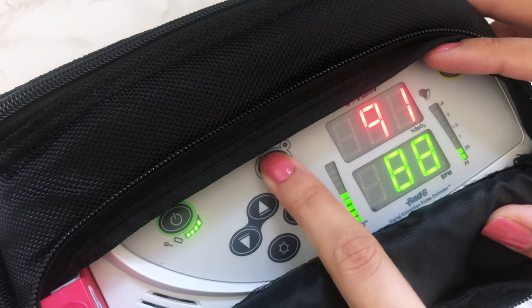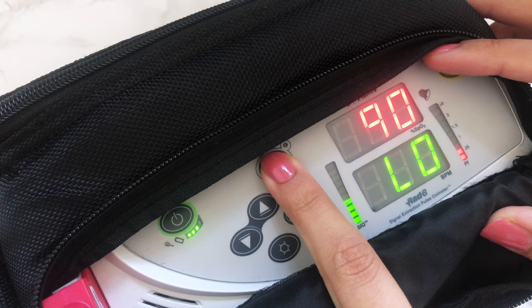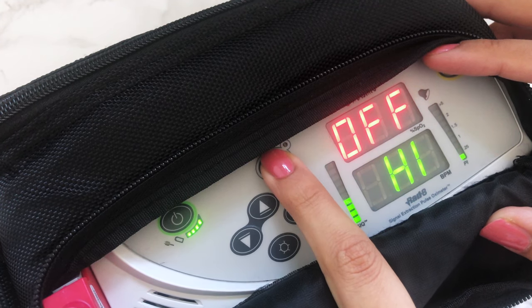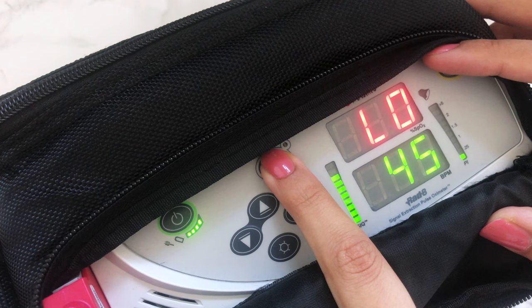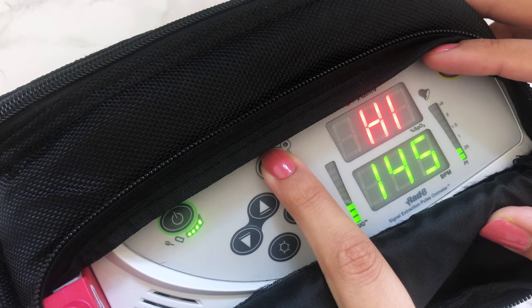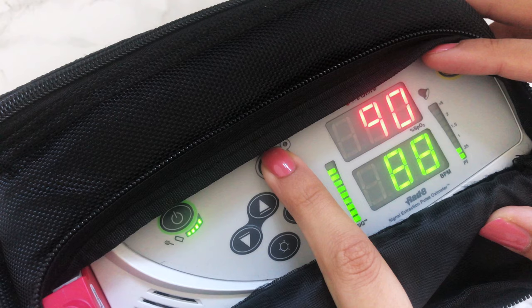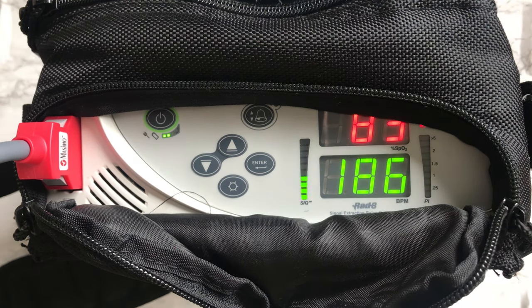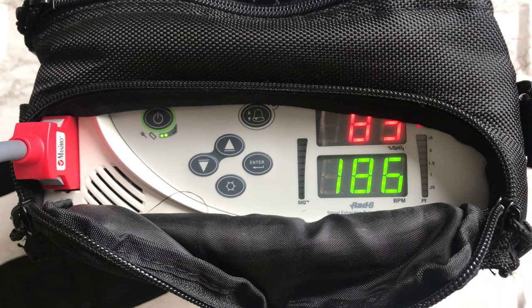These are mostly factory settings. The alarm button switches between saturation and pulse settings. The low oxygen setting is set to 90, the high oxygen parameter is off, the lowest pulse rate limit is 45, and the high pulse limit is 145. Every oximeter is different based on each individual's needs. Any parameter that goes beyond the programmed number will set the alarm off.